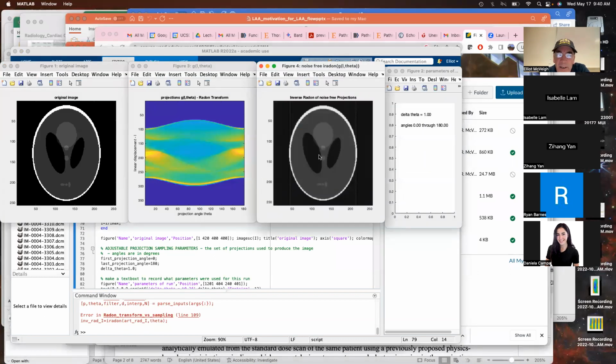Now in the background we've fixed a lot of that sampling, but off these really sharp edges here, you still see some streaks coming down. That's due to the fact that the projection between the 2 angles at this vertical view doesn't sample this edge highly enough.